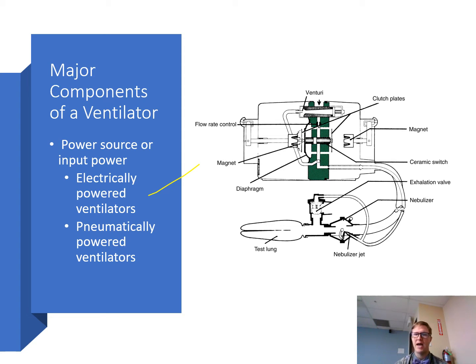Electrical power can also be used to operate other devices inside the ventilator besides those, like fans, bellows, solenoids, and transducers. All those devices help ensure a controlled pressure and gas flow to the patient. So these are very important internals, and that electrical energy is going to be pretty important to have for those ventilators that have all those things.